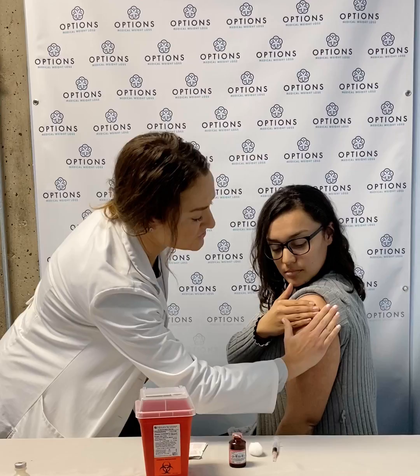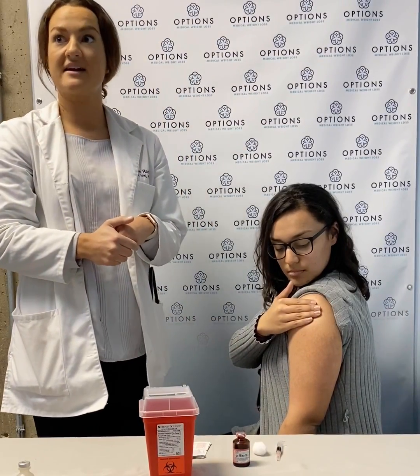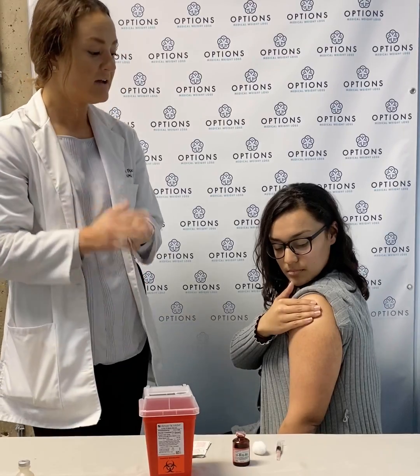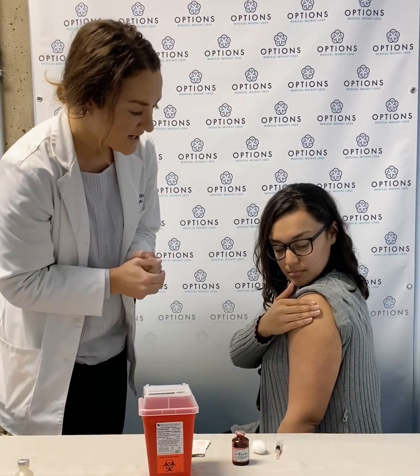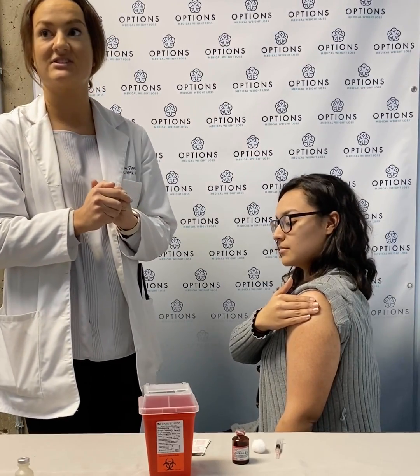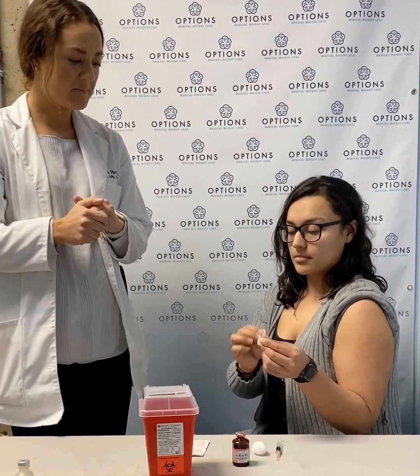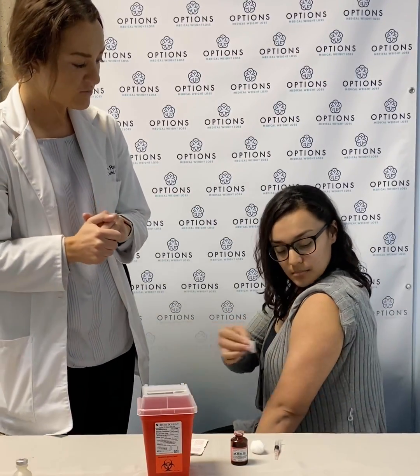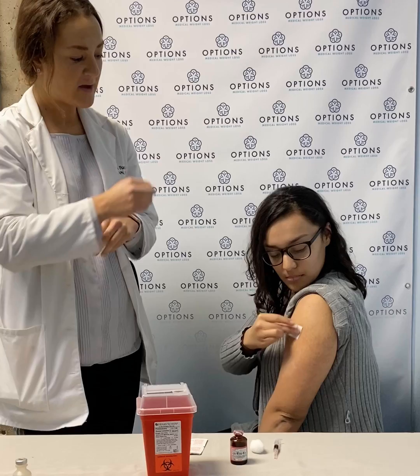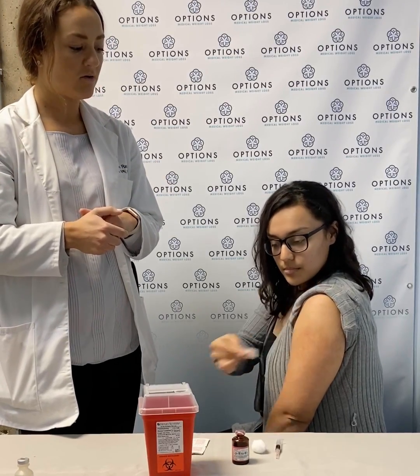Anywhere in this general triangular area here of the muscle is perfect. So you have a lot of room here to work. We have a point of reference. Now the next thing we need to do is just clean the area. So Leslie is going to take her alcohol wipe. Take out your wipe, and then you are going to work from that point outward in a circular motion so that the whole area is clean.